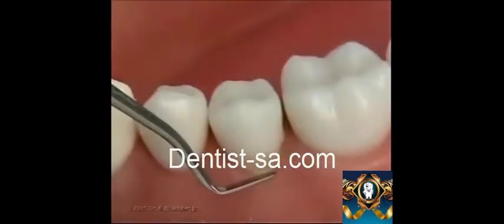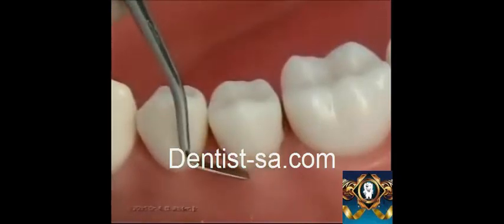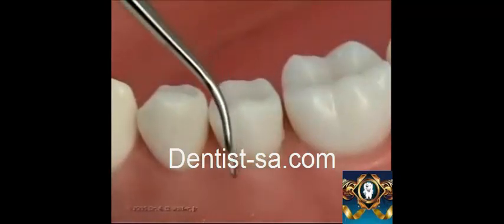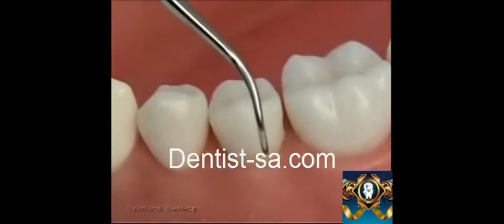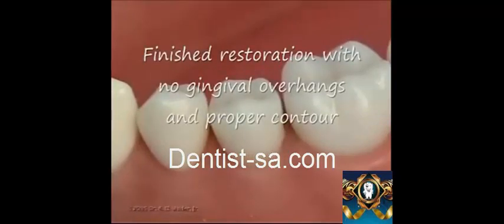And this is the finished restoration, showing excellent contour, excellent shape and excellent shade matching. There is no discrepancy between the tooth surface and the restoration surface.